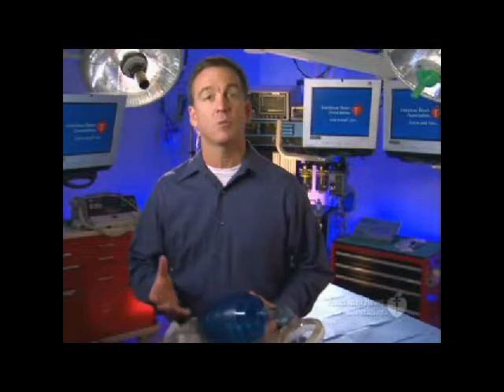The bag mask system is the most common method of providing rescue breathing in healthcare settings and during 2 Rescuer CPR. It can be used with or without an oxygen source and comes in a variety of sizes. If you're using supplementary oxygen with the bag mask, the delivery method is exactly the same as without supplementary oxygen.